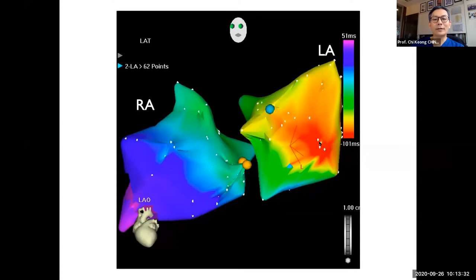And why do we see a concentric or septal activation of the atrium? Let me show you. It was extensively ablated previously, and as a result, the operator has achieved a conduction block in the coronary sinus region, just septal to the location of the accessory pathway.